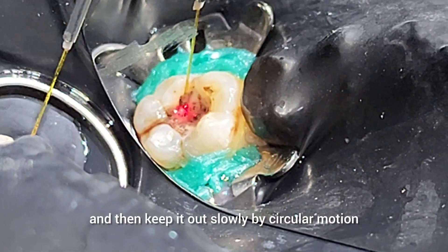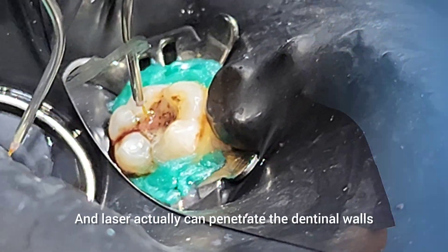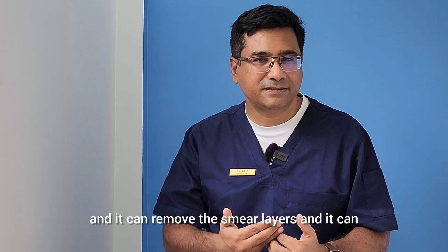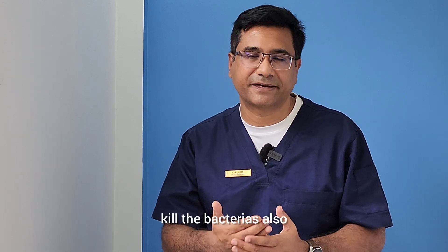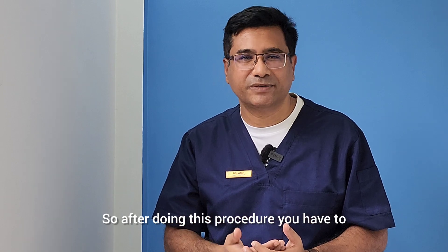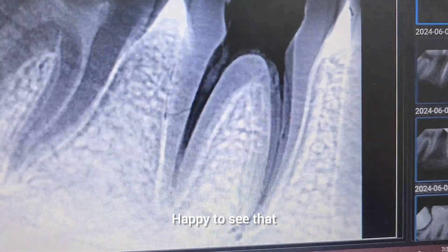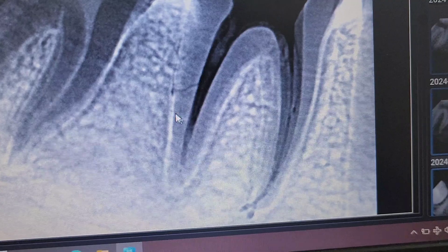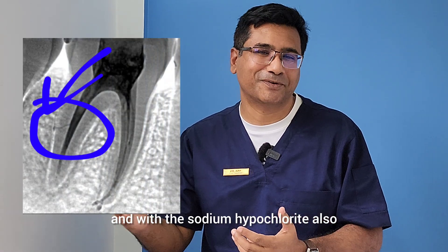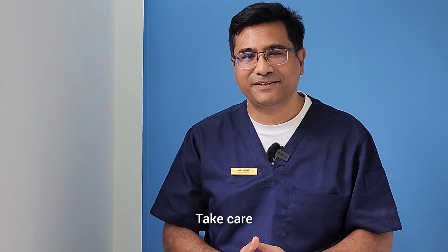After giving the sodium hypochlorite, gently insert the tip in a circular motion from the coronal portion to the apical portion, then slowly withdraw it by circular motion. The laser can actually penetrate the dentinal walls, remove the smear layer, and kill bacteria. After doing this procedure, irrigate the canal with normal saline and seal it. This procedure can also open lateral canals, and combined with sodium hypochlorite it is very effective. Thank you very much — I hope this video is helpful for fellow colleagues. Take care, goodbye.